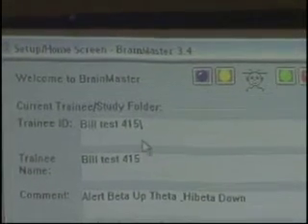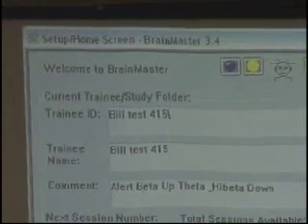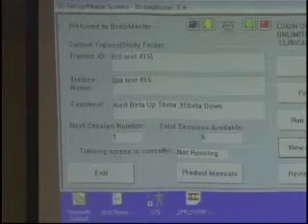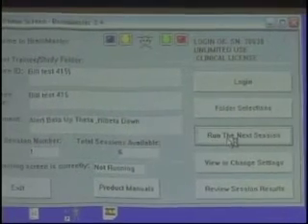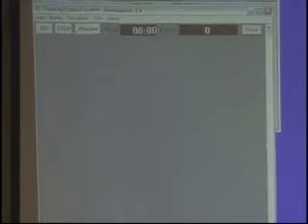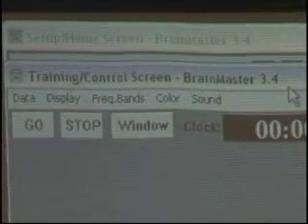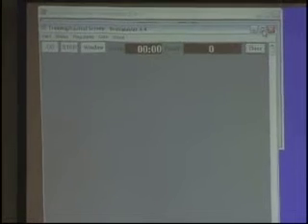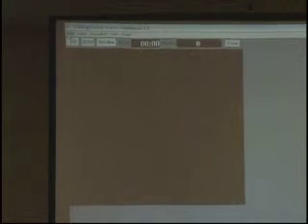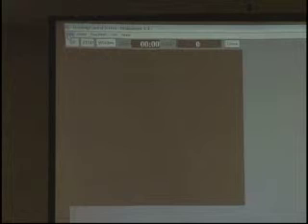We're back at the setup home screen. We can see our trainee ID, the folder we built, the comment field. Now I'm going to hit 'Run the Next Session.' The next window that comes up is the Training Control Screen — BrainMaster 3.4. Let's look at a couple of different things we see from this screen.